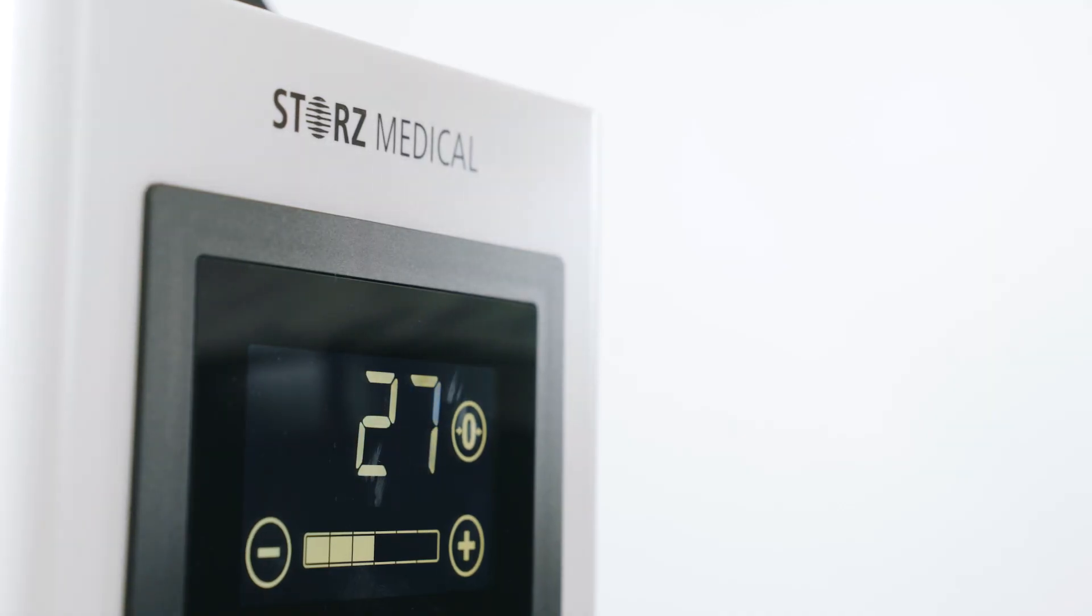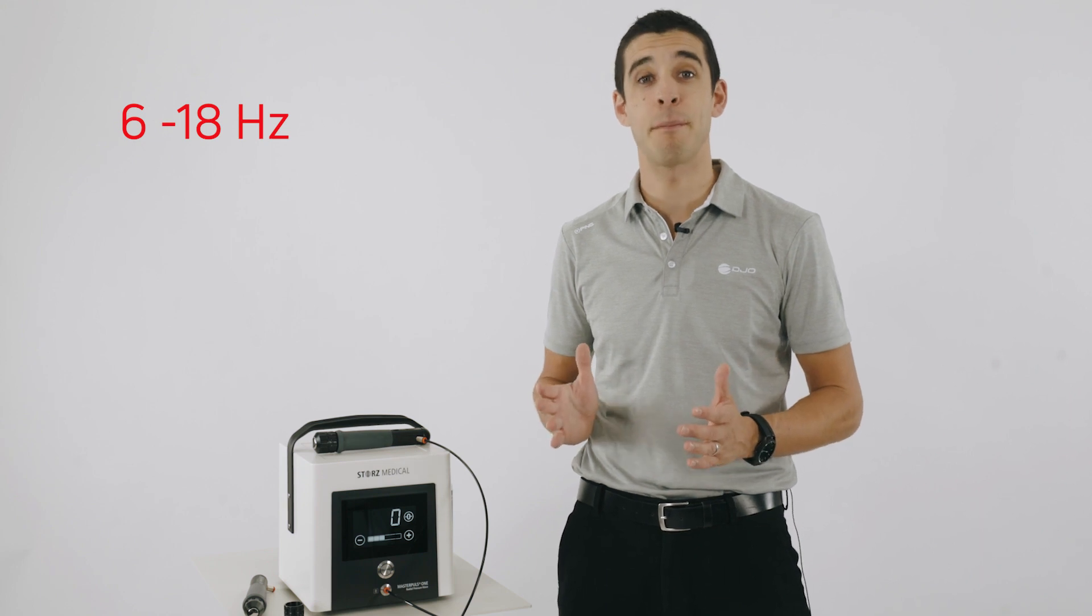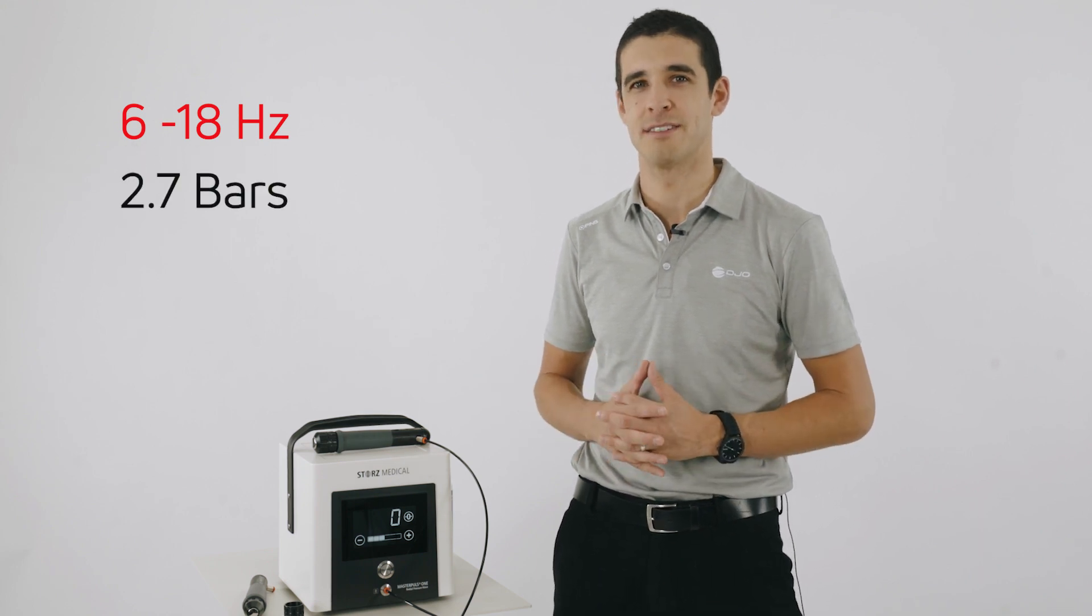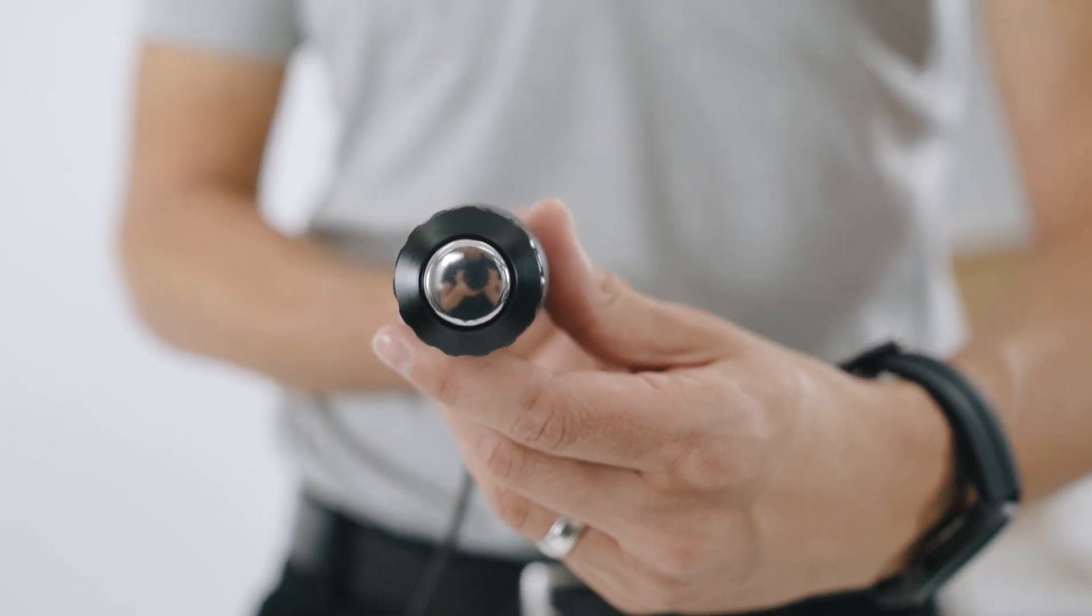The Master Pulse 1 has 6 energy levels ranging from 6 to 18 Hz with a maximum bar pressure of 2.7 bars. The newly developed Radial Sparrow handpiece is unique in the market thanks to its lightweight design and ergonomic shape.